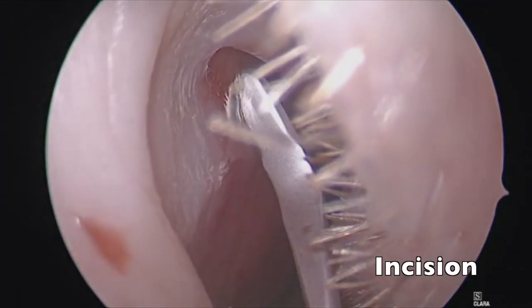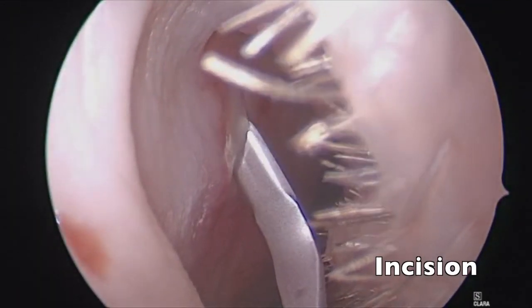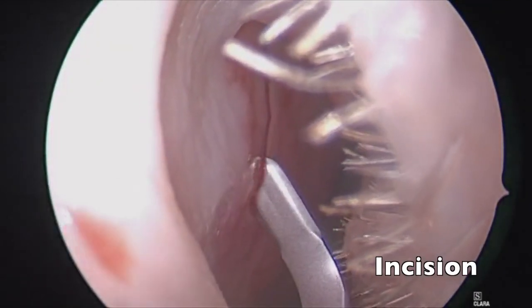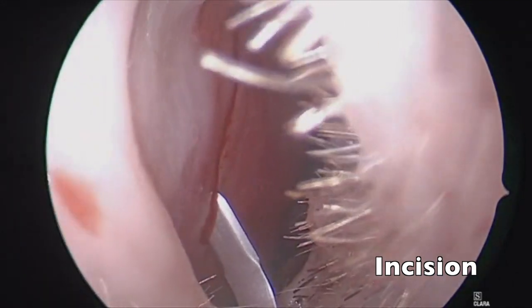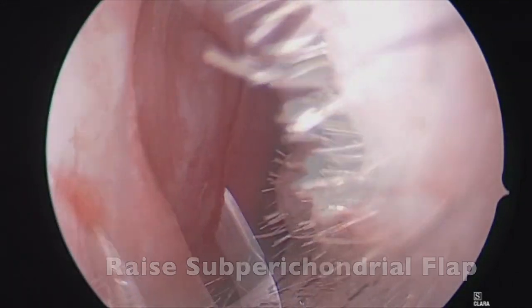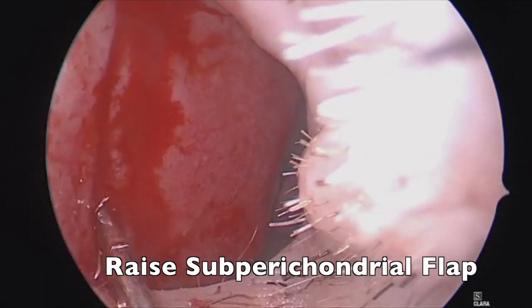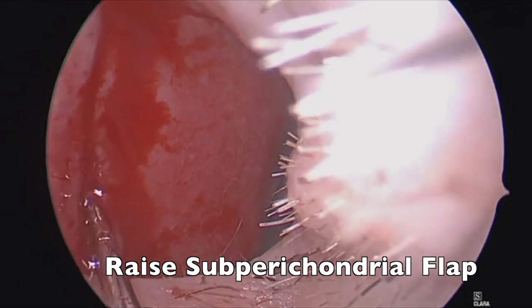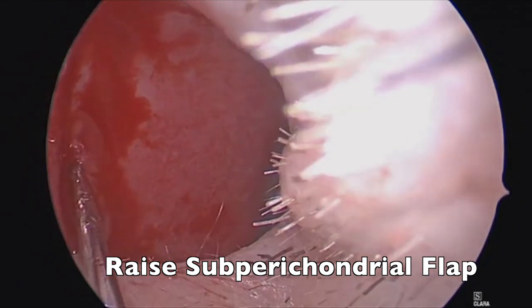Here we are with a curved beaver blade making a rather anterior mucosal incision. The idea is to get this through the mucosa and through the perichondrium, but of course not through the cartilage itself.